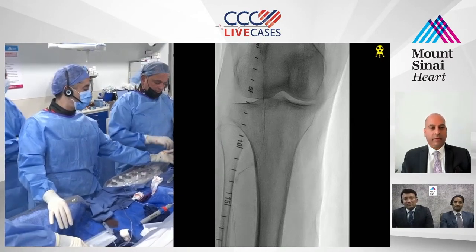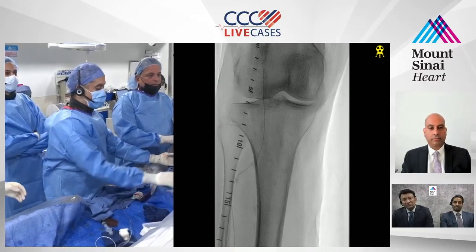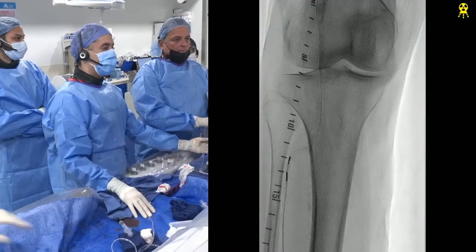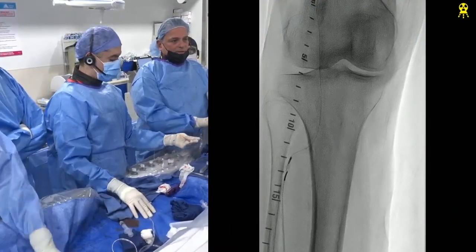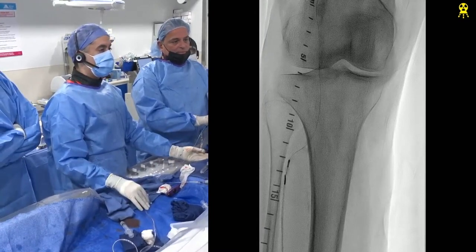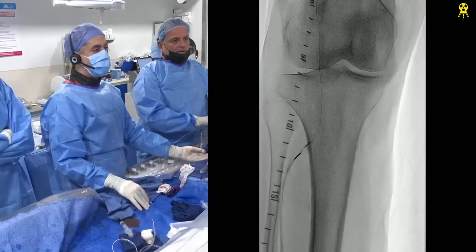Oh, really? Fingers crossed. Fingers crossed. I knew this would be an interesting case, but not for these reasons. Is this wire a stiff wire? It's a stiff wire. It's extra stiff. Yeah. Come on. Wow. I feel like this probably has less trackability than the Alpha. Yeah, I agree. There it goes.